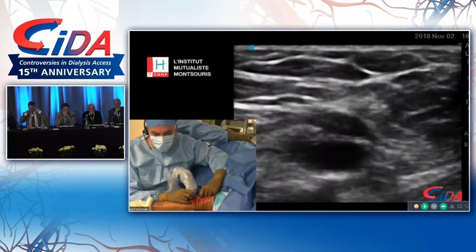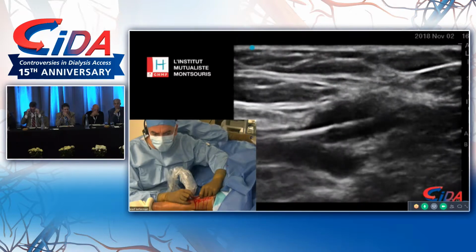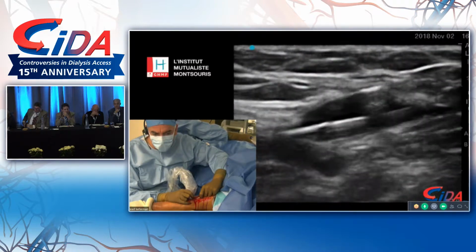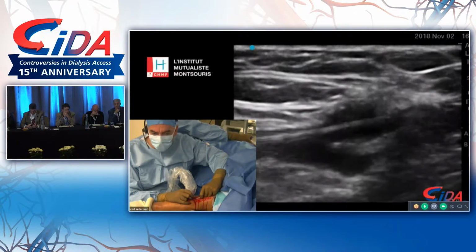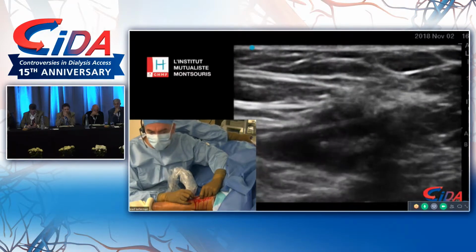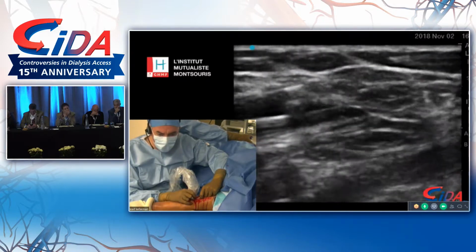You see that we were successful in creating a water-tight seal anastomosis because we have the balloon inflating the perforator. There is no hematoma or anything else created around the artery, so this means that we have a good and solid anastomosis. Okay.